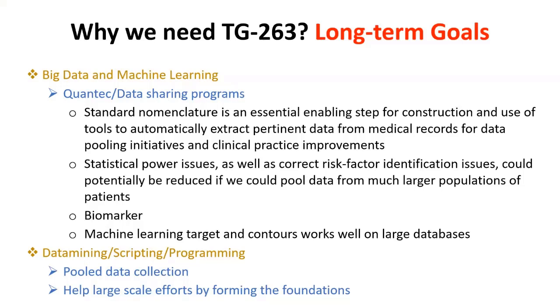Data sharing programs are also very important. Statistical power issues, biomarkers, machine learning targets and contours work well on large databases. So you can let the computer do the contouring for you. This can be easily done if you have enough data classified in the proper way. Data mining, scripting, programming, pooled data collection, and helping large-scale efforts by forming the foundations.